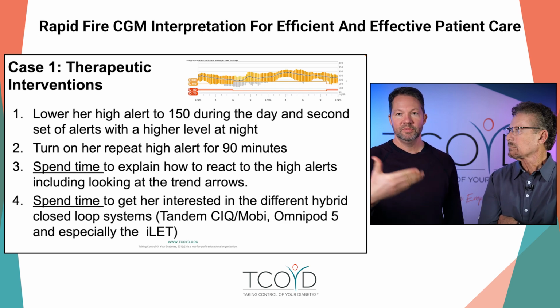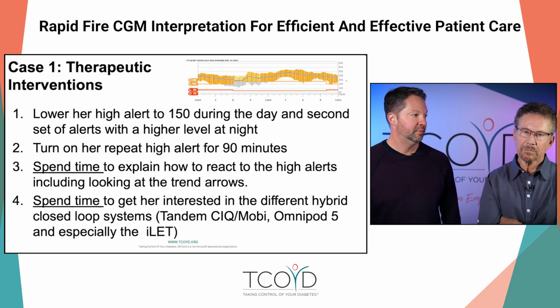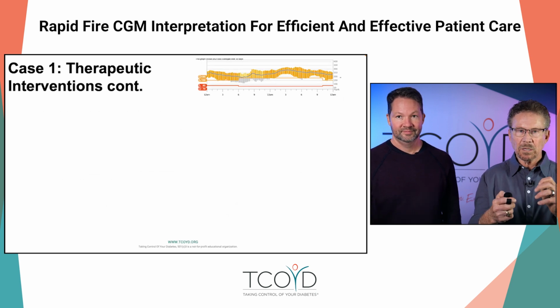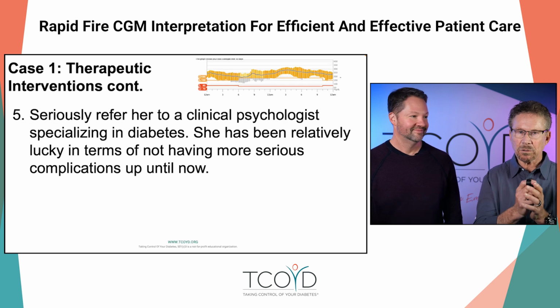So I assume that pumps have been brought up to her probably multiple times. Yeah. But this is another good time to bring it up again now that there's a new system to talk about. All right. We're spending way more time on the therapeutic interventions, but we still have 7 more cases to do. So to make a long story short, she needs help.